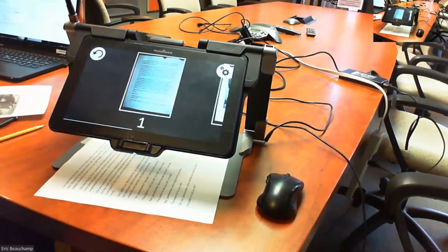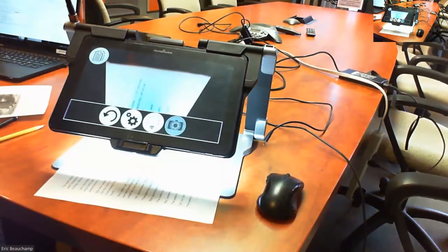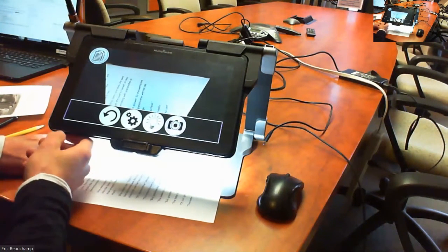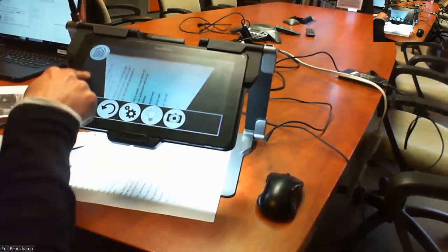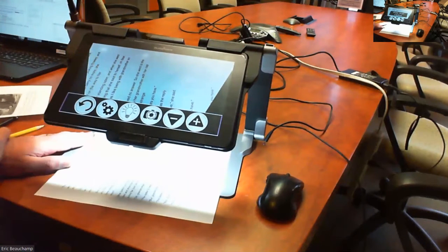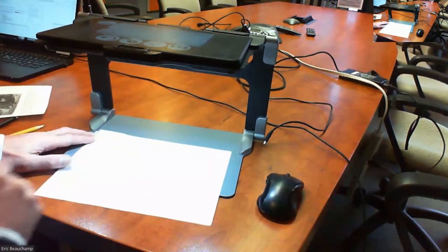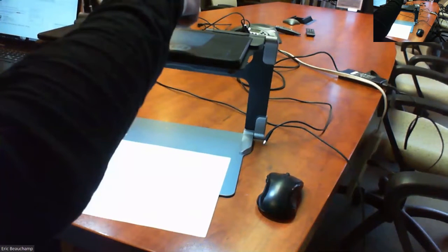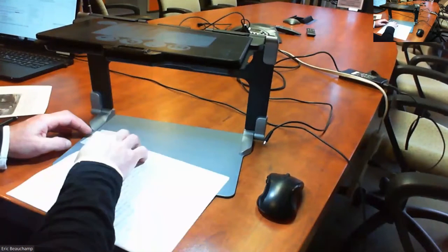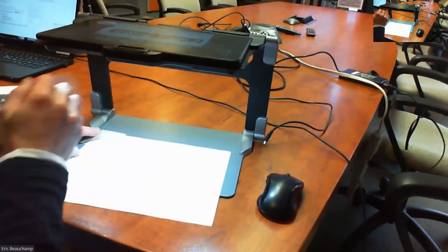We're always upgrading the Prodigy software, always trying to get this Mag Connect working perfectly for you guys and getting the technology in the hands of the children, of the students. So again, multi-page. You swipe on the left-hand side, it goes from live mode to one capture, or swipe again, multi-page. Once you're into multi-page, just bring the tablet up, 90 degrees up, parallel, press and hold on anywhere on the screen, take a capture, change the page, take that capture again, press and hold on the screen. You'll be saving the pages like that.